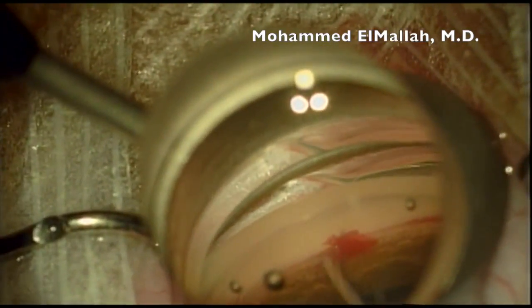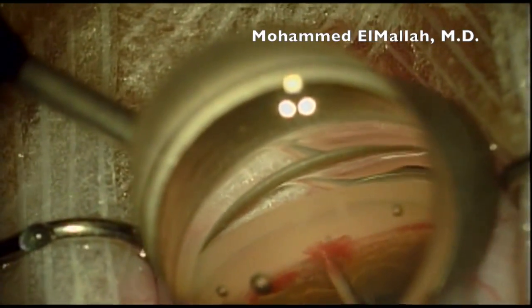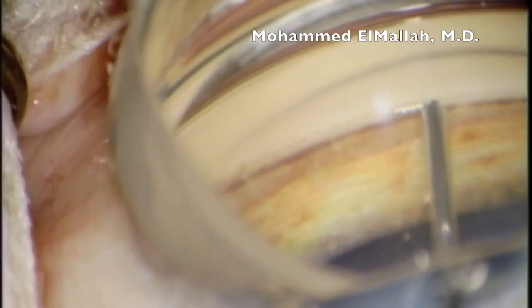When the device is inserted, it's normal to see reflux of blood, and it's actually an indication that you are in the proper position. You also want to test memory by tapping on the device and ensuring that if the device moves, it returns to the same position — also an indication that you are in the correct position.